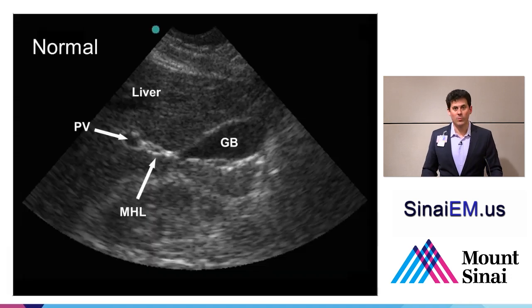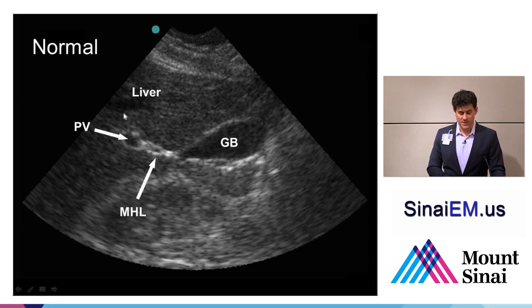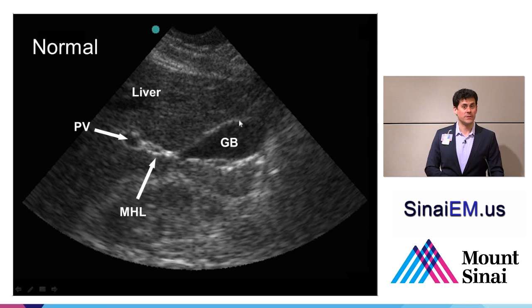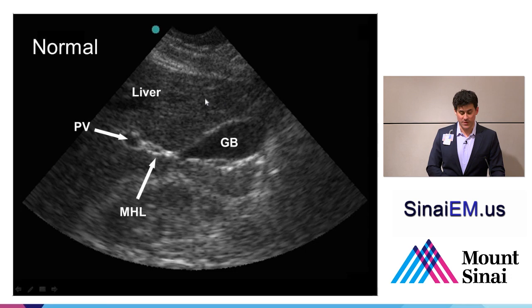Here's a pretty normal view of the liver in what's often referred to as the exclamation point sign, where the point of the exclamation point is the portal vein, the middle hepatic ligament connecting the two structures, and then the gallbladder forming the top part of the exclamation point. We can see the anterior and posterior walls of the gallbladder demonstrated pretty well. Note how crisp and sharp the anterior wall looks — that's where we'll look for gallbladder wall thickening later on.